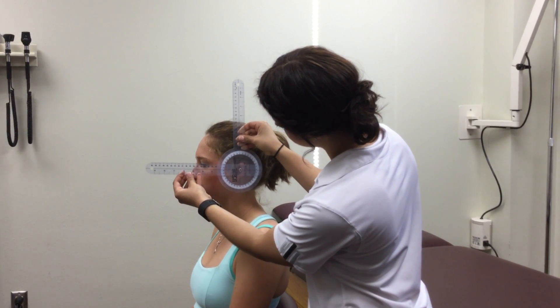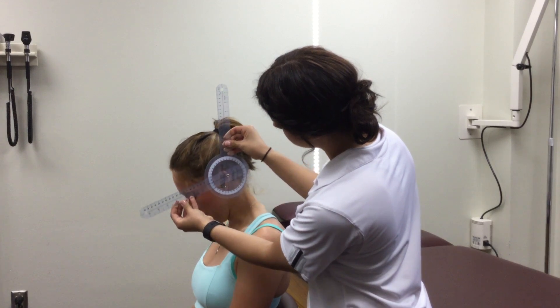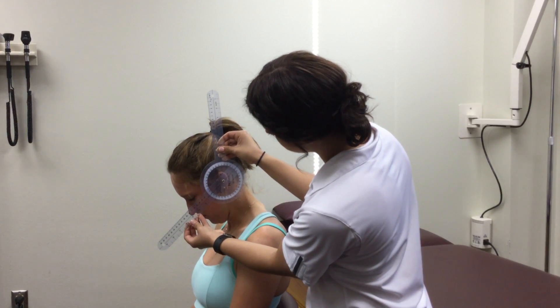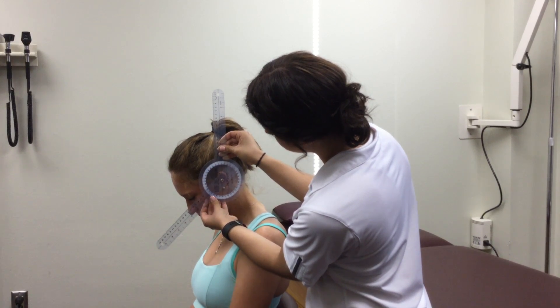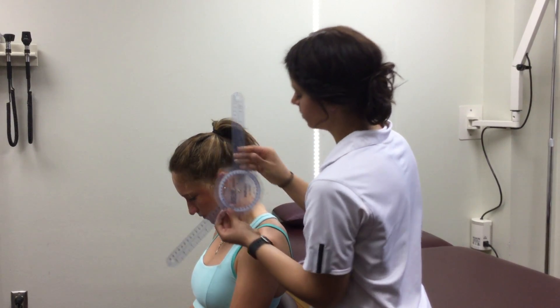Actively have the patient bring their chin towards their chest and record the change of the reading in degrees. In addition, you will note any pain or difficulty present on the recording sheet.